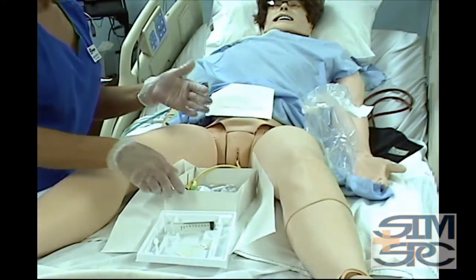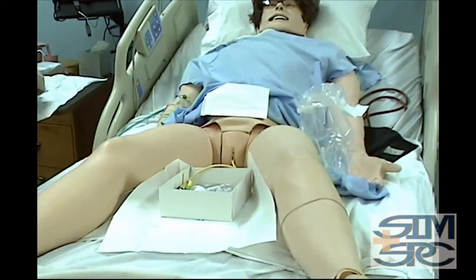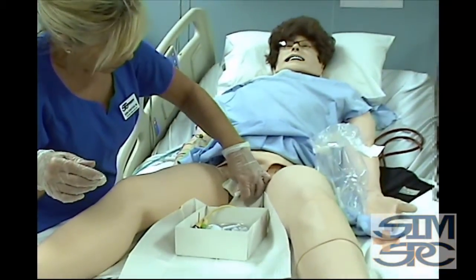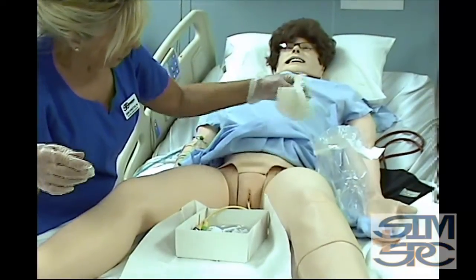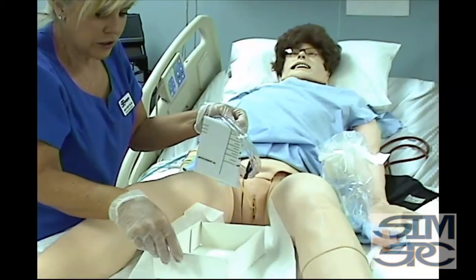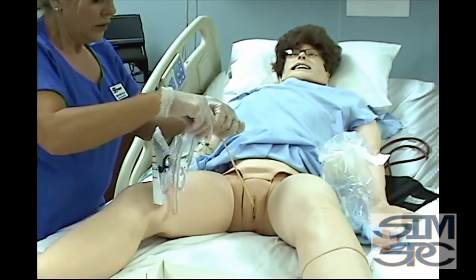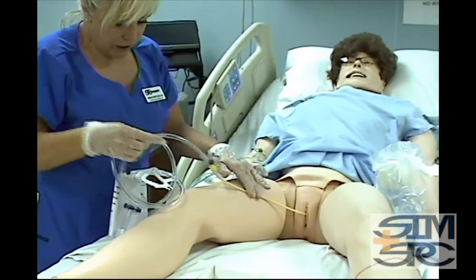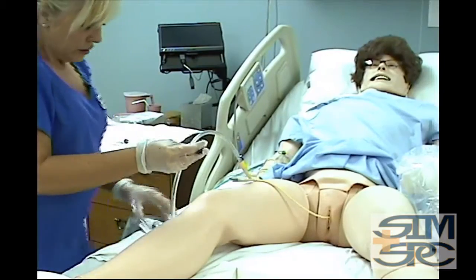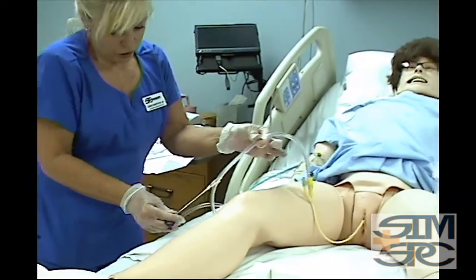Now you're through with that part. If you want to, you can go ahead and move this off. You can go ahead and take this to clean your patient from the extra KY betadine. And now you're ready to go ahead and secure your Foley bag. Okay. If you want to, you take to the inner thigh. Sometimes even these have a little place on the tubing here that you can connect. Depending on where it is, you can pull it down.